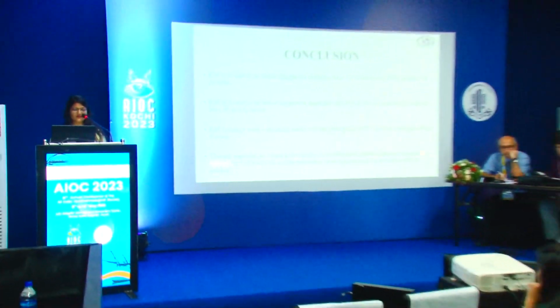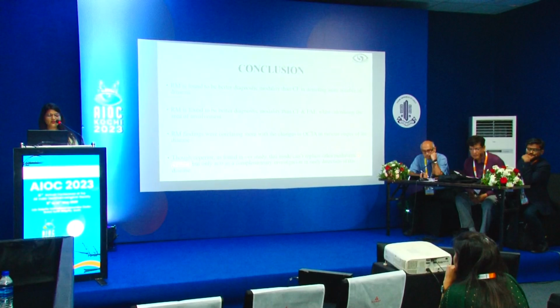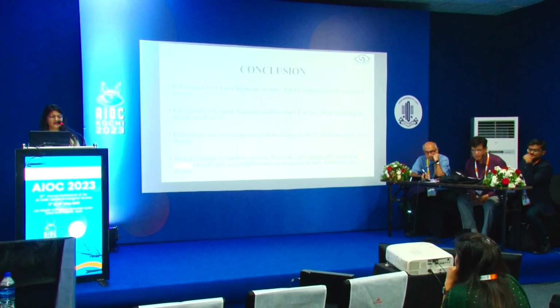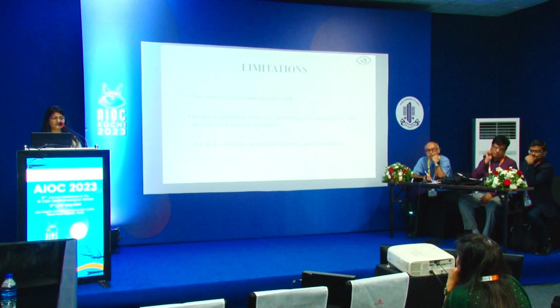So to conclude, retro mode is found to be a better diagnostic modality than the color fundus photo in detecting more number of drusen and also in the area of involvement. Retro mode findings were correlatable with the OCTA in the various stages of the disease. Though superior, as found in our study, this mode can't replace other modalities at present. It can act as a complementary investigation in early detection of this disease.